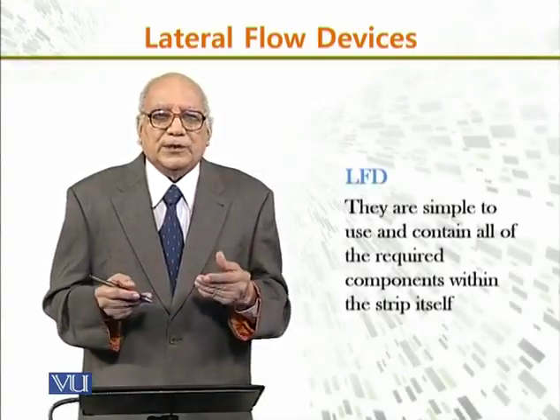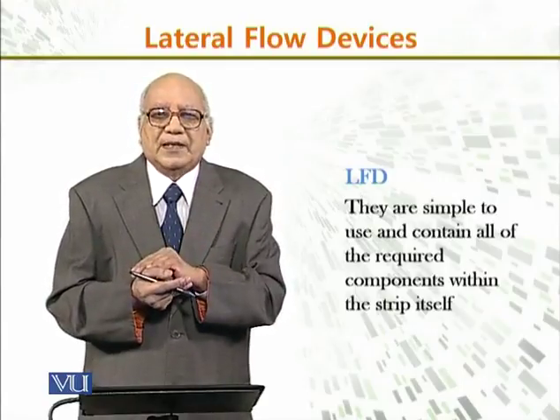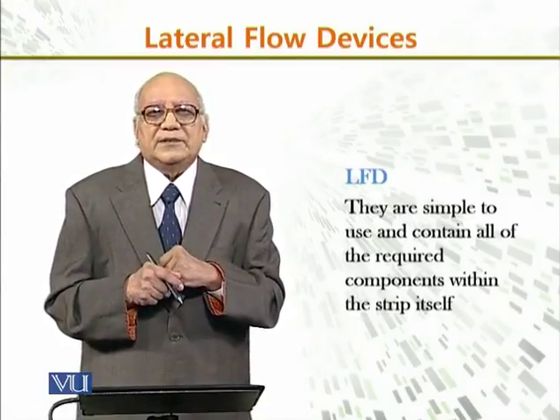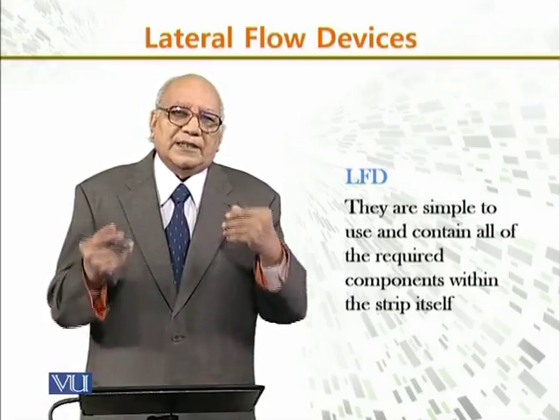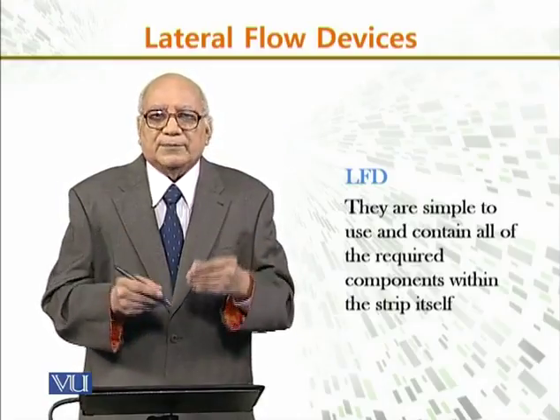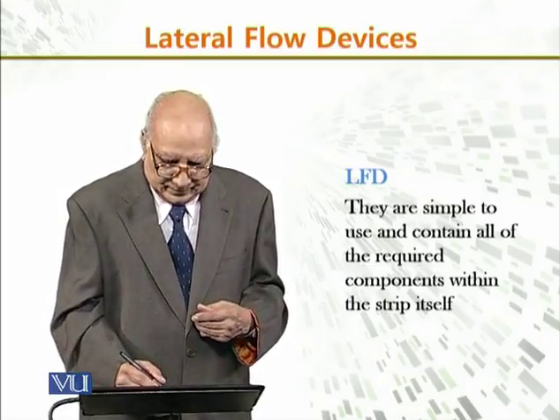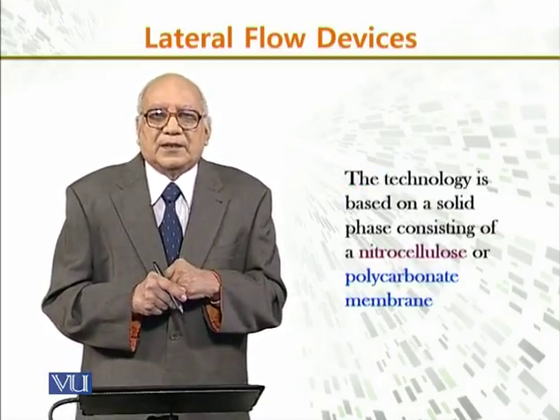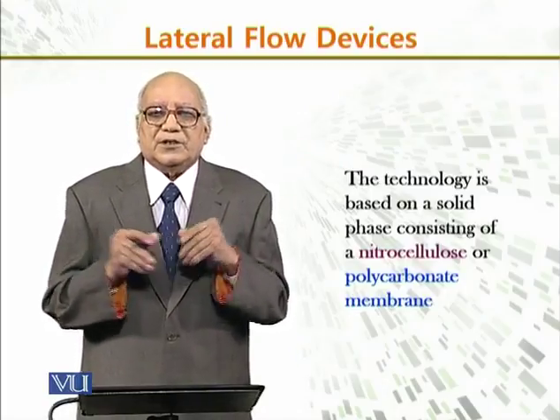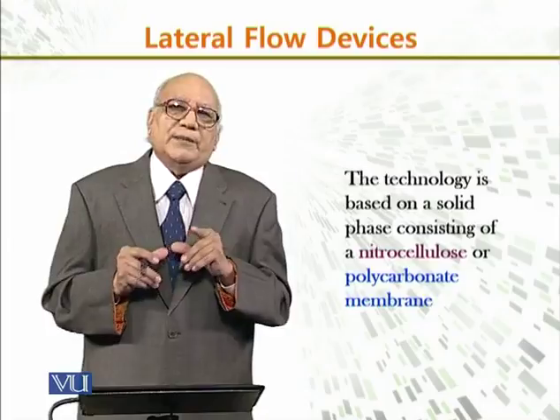Lateral flow devices are simple to use, as we can see, and contain all of the required components within the strip itself. That is the antibody beads, other material, and color indicators, which will give a result. This technology is based on a solid phase consisting of a nitrocellulose or polycarbonate membrane.